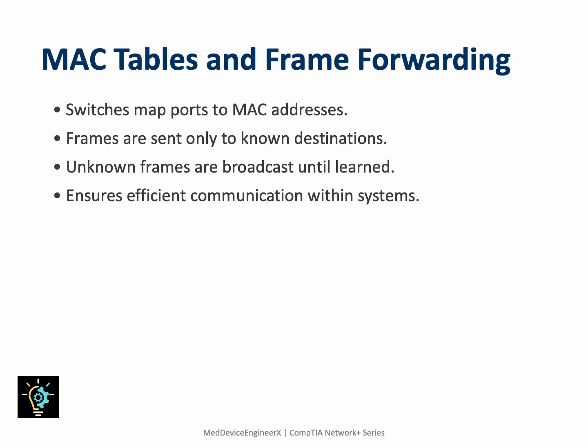Switches use MAC tables to determine where to send frames. For example, within the Valleylab FX8, Ethernet connections link internal processors and service ports. When a technician connects a laptop for diagnostics, the switch quickly learns its MAC address to route traffic efficiently. This prevents congestion and maintains smooth communication between subsystems, which is vital in time-sensitive environments.